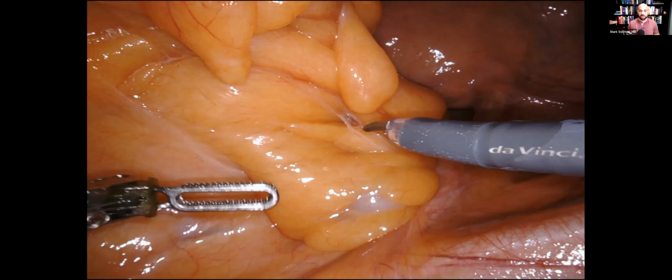And again, we want you to ask questions and comments and criticisms along the way as well. Okay, so let's talk about the infra-IMA. What I want to do first here is show you the robotic setup. Because this is a challenging thing when we get to the OR, is okay, you saw the videos of how to actually do it, but how do you make the exposure look right? So this is how I do it here.